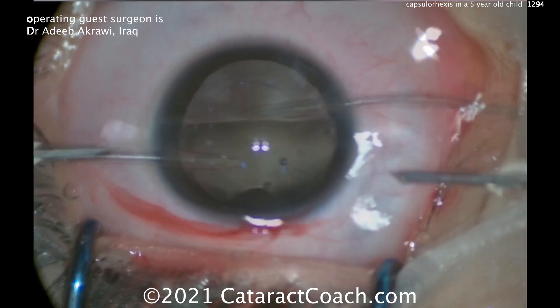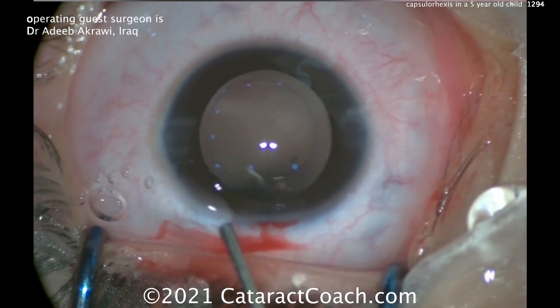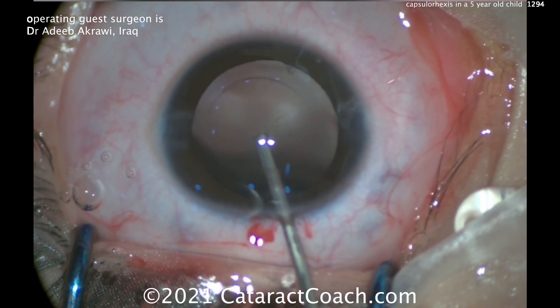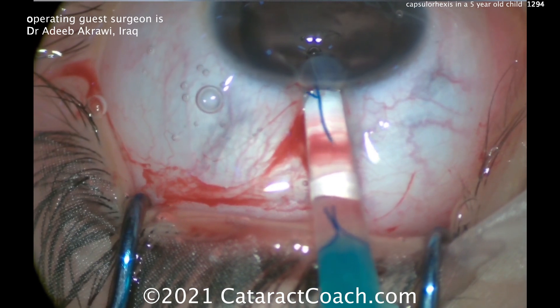Taking out the last bit of it — you can see it's cleaned up very nicely. Now in all likelihood you're going to have to do a YAG capsulotomy for this child, but I think a 5- or 6-year-old child can easily sit still for YAG capsulotomy. So I don't think you need to do a primary one — you can just get the lens in the bag.